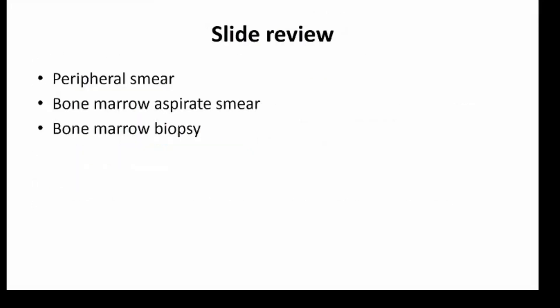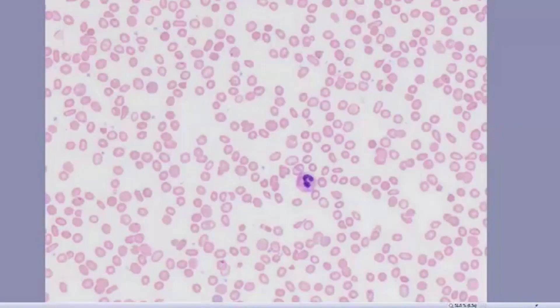I'd like to now go over some of the slides, including the peripheral smear, which I consider to be an essential component whenever we're reviewing a bone marrow. We should look at the peripheral smear as well as the bone marrow aspirate smear and bone marrow biopsy. Here's the patient's peripheral smear seen at 40x magnification. You can see that there's quite a bit of anisopoikilocytosis of red cells, including target cells, as well as some elliptocytes and a lot of variation in cell size.